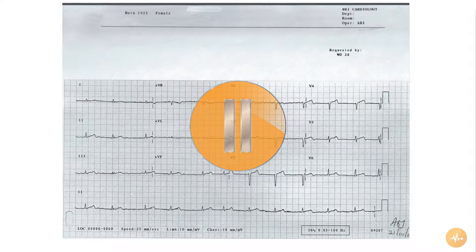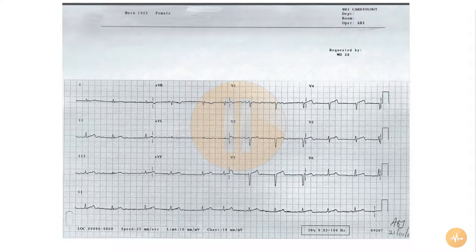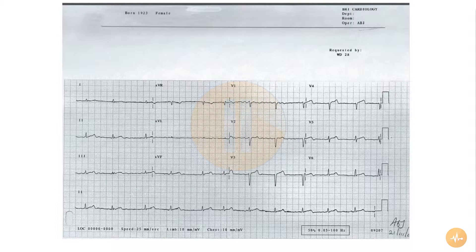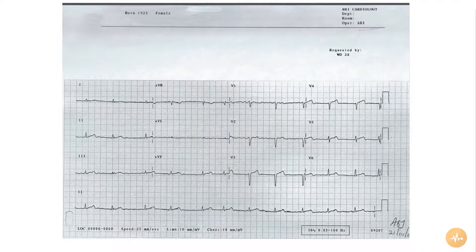Pause this recording now and interpret the ECG on your own before pressing play again to hear me interpret the ECG.